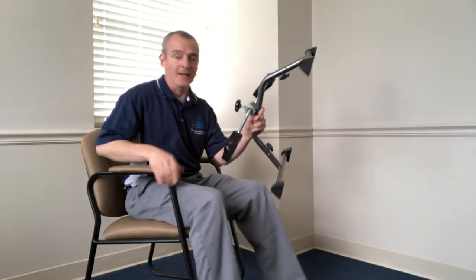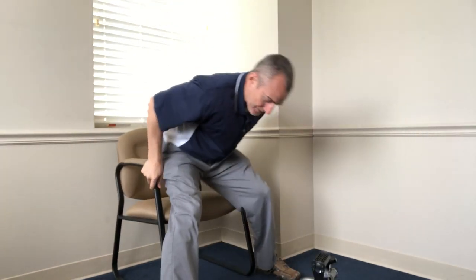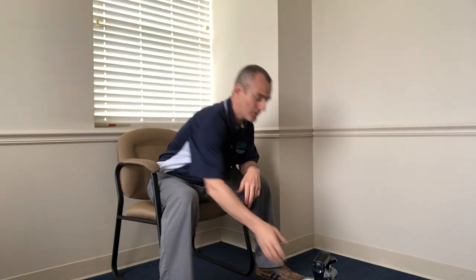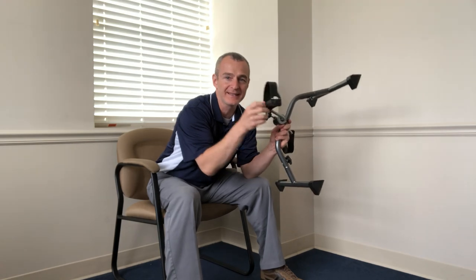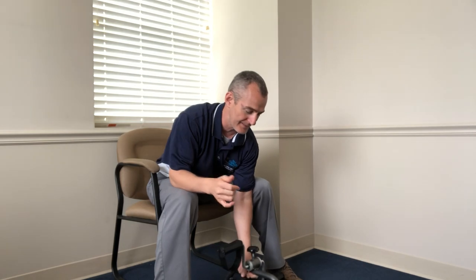My chief priority is your safety. My biggest concern when anybody uses one of these little bikes is that you don't tip over in your seat. When I put my feet on here, it's easy to push myself back so hard the chair tips over. So usually I set people up with the chair back against the wall — something that can't move. Also, either cut the foot straps off or just don't use them and put your foot on top of the pedal. The straps are too small for most feet anyway.